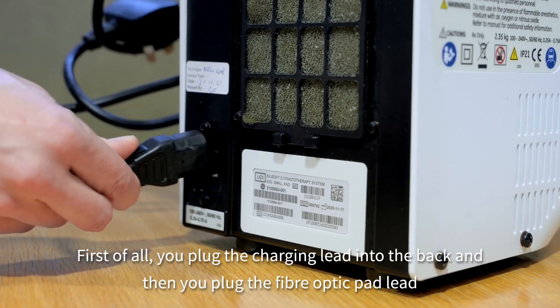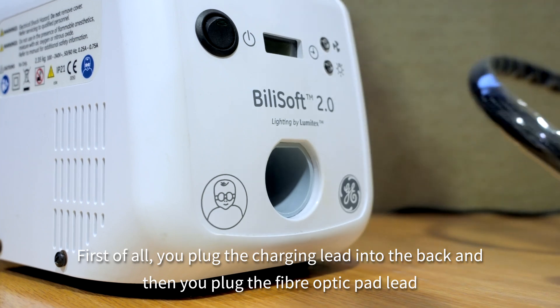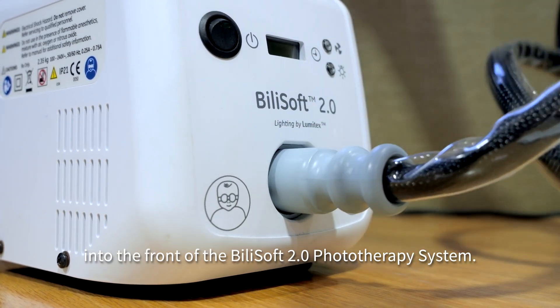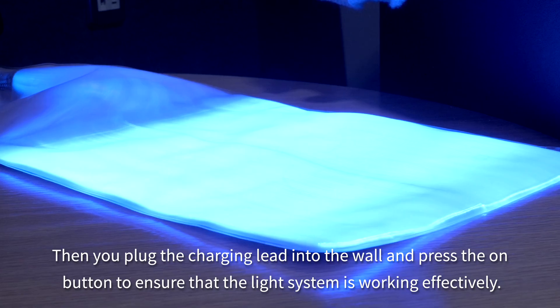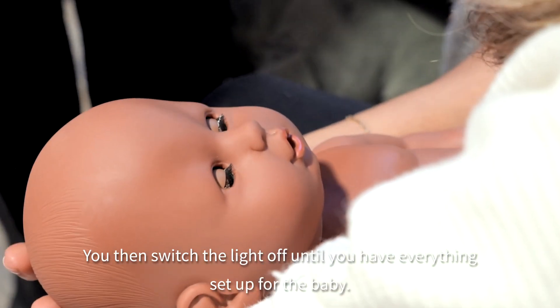First, plug the charging lead into the back, then plug the fibre optic pad lead into the front of the Bilisoft phototherapy system. Plug the charging lead into the wall and press the on button to ensure that the light system is working effectively. Then switch the light off until you have everything set up for the baby.